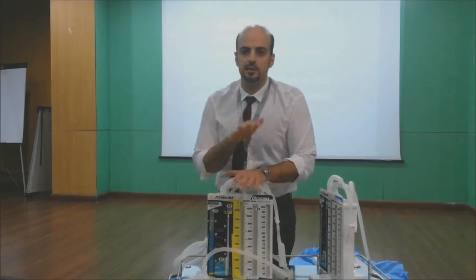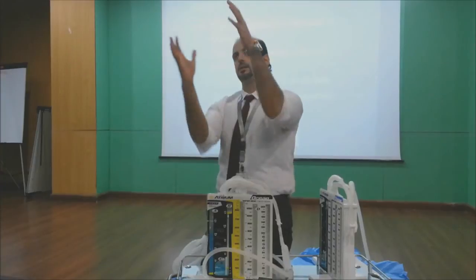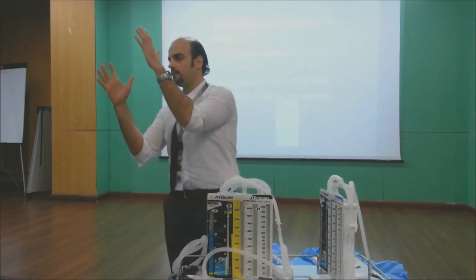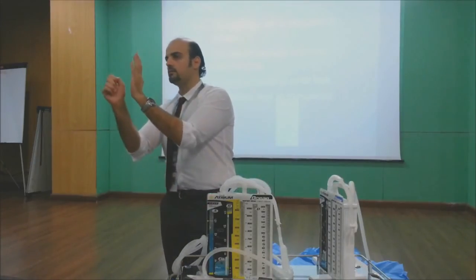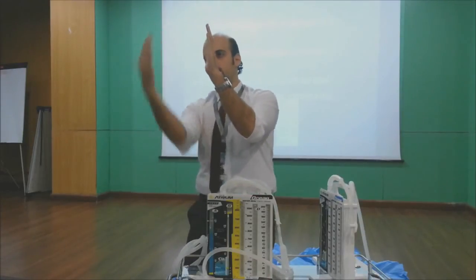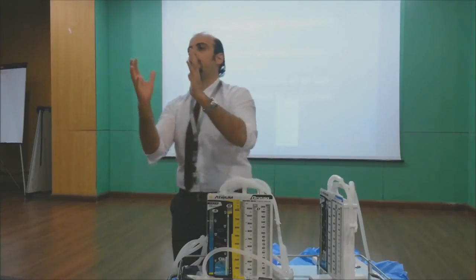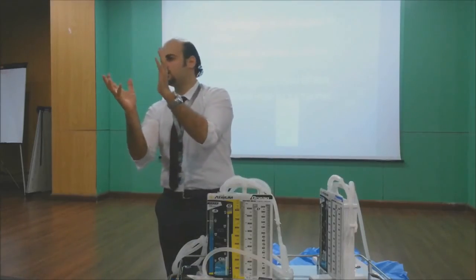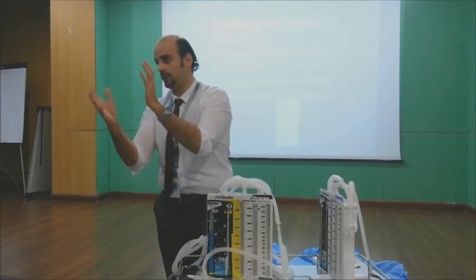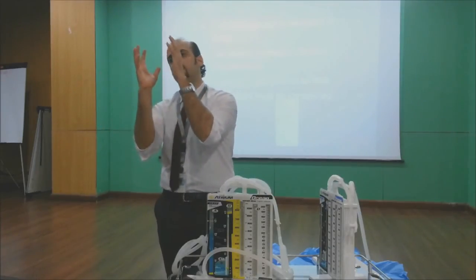In a chronic patient, imagine this cavity, okay? I put a chest tube to drain some pus or fluid. Imagine this cavity. The visceral pleura is here, the lung is here, and the parietal pleura is here. What happens with the pus or the blood, prolonged? It will fibrose, okay? So this is a steady cavity.